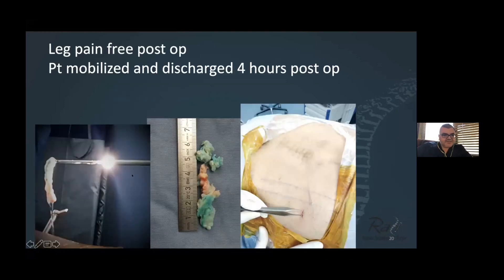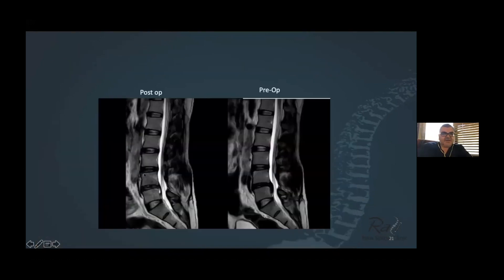This is the transforaminal approach. That's the total amount of fragment removed — a huge five centimeter fragment, as you can see. This is the pre-op MRI on the right, and this is what you have only on post-op MRI.